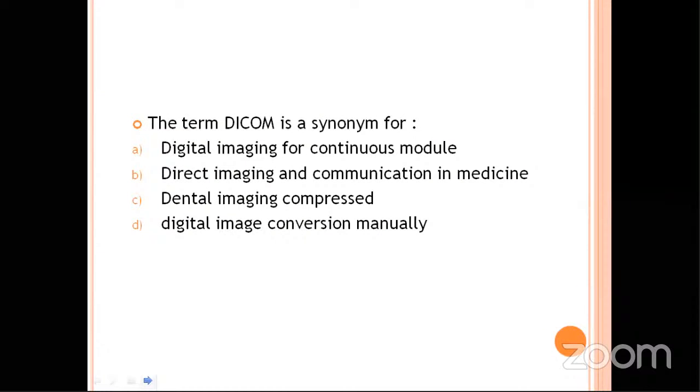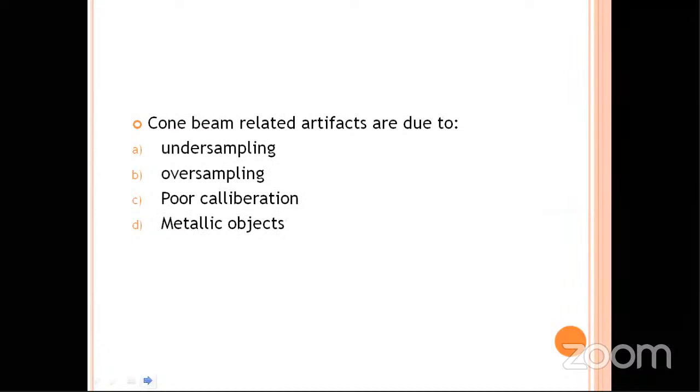What does the term DICOM mean? You transfer the images by means of various systems. அதாவது ஒரு போட்டோவா இருந்தா JPEG ஃபைல் அந்த மாதிரி சொல்றோம் இல்லையா? ஸோ அந்த மாதிரி மெடிக்கல் ரிலேட்டட் டேட்டா we transfer it by means of the DICOM file, which is called as the digital imaging and communication in medicine. Okay, so that is called as digital imaging and communication in medicine.